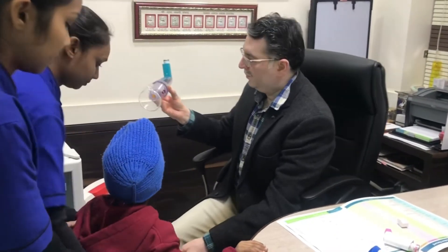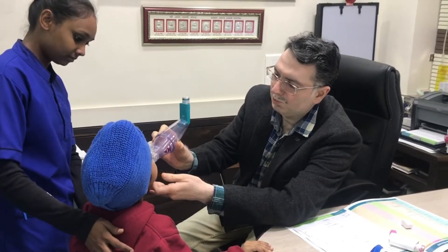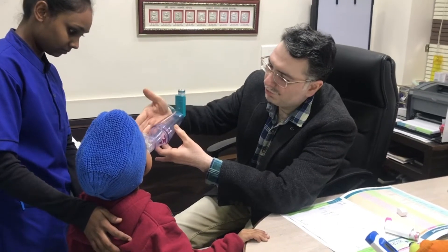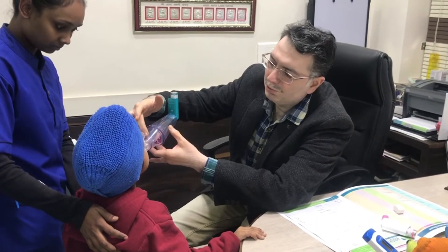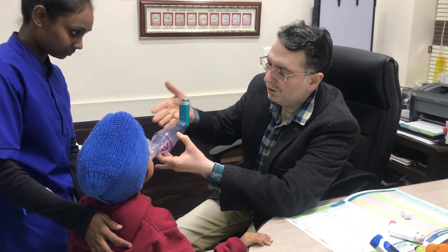When you are looking at the child's face, we cover it with a little bit of an angle so that the valve can easily open when the child breathes in. It's like a little bit of a lift.